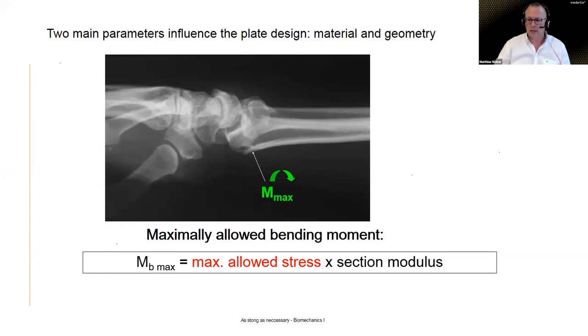Okay, Alexander just raised a quick question from Paulina. Can you explain, if every titanium implant is non-magnetic, what happens with other materials? Well, titanium is a non-ferritic material, so hence it is non-magnetic, or it's not really magnetizable. What happens with other materials? Now, obviously, all those ferritic materials like stainless steels, they certainly will create some kind of artifact.